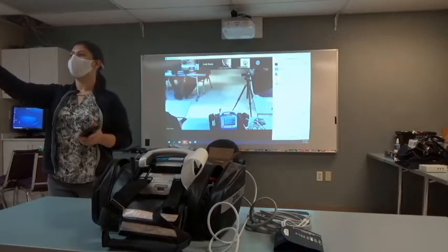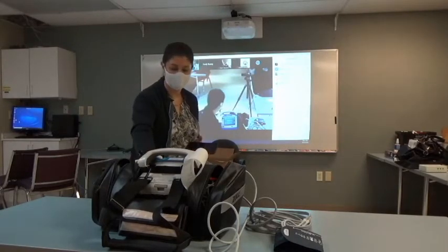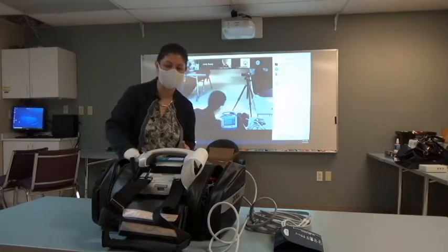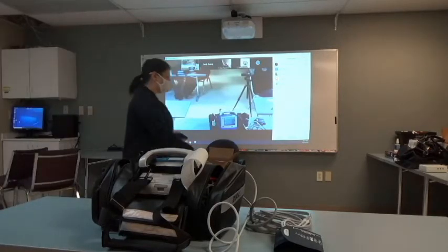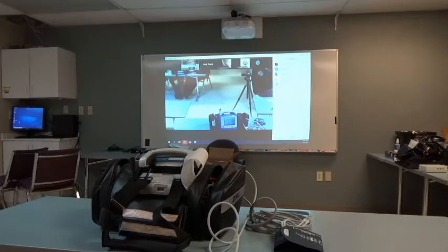That's fine. So for this side of the room, we're going to do the same thing. We're going to find the envelope. We're going to scroll until we find the word test. Press the enter key, and then go down to transmit and press enter. You're looking for a green light on the top of your device, telling you that you're transmitting the data, and you should get green transmission complete. And that's how fast the hospitals are getting them.